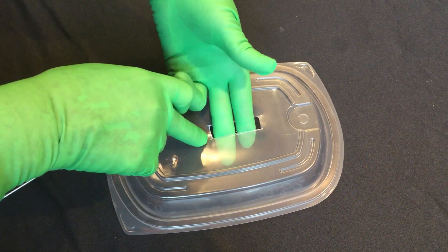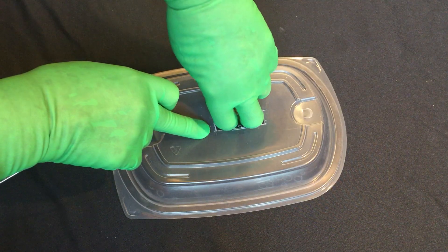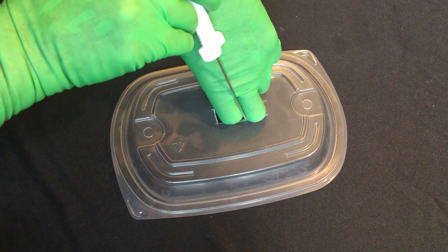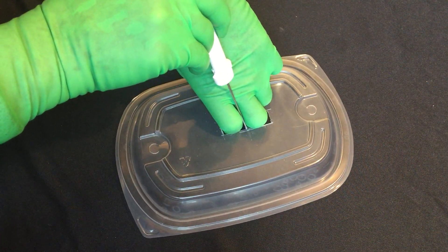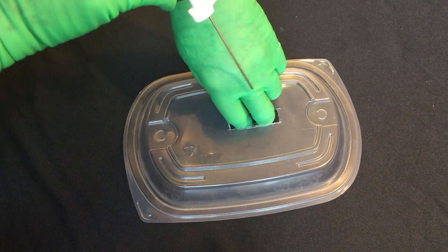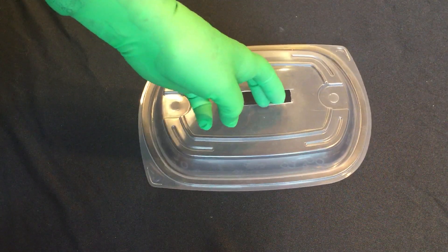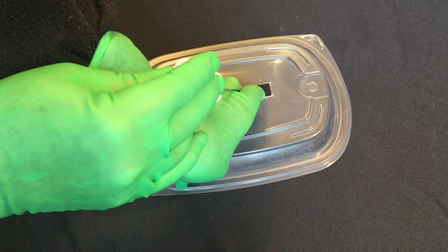What I found works better now is I go in with my fingers like this and still pull up on the abdomen, but I'm sliding down the back of my hand and fingers to catch the fascia that way. You can see that's much safer than trying to go in with my fingers in the front. And when I go to the other side I turn my hand and go this way to catch the other side the same way.